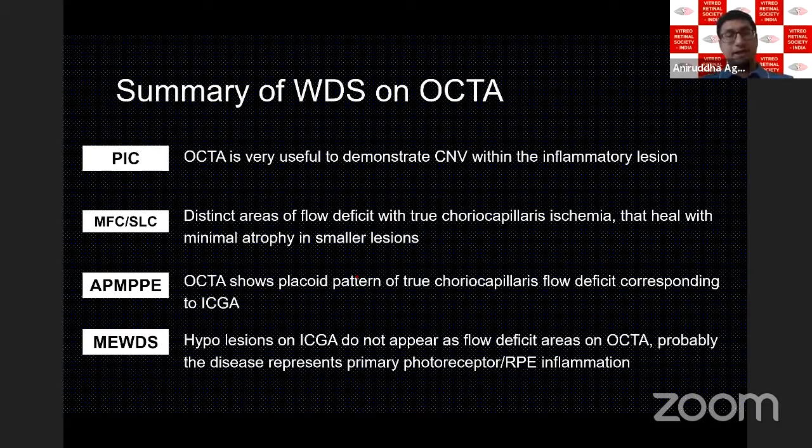And finally, to summarize, there have been number of studies using OCTA in retinal vasculitis. There is no such consensus right now to determine whether OCTA really is very useful in retinal vasculitis. Yes, it is useful in occlusive vasculitis to determine presence of macular ischemia and capillary non-perfusion, but this is one area of research which needs further focus, and we need to wait to find out if there are more studies coming up to help us in this field.